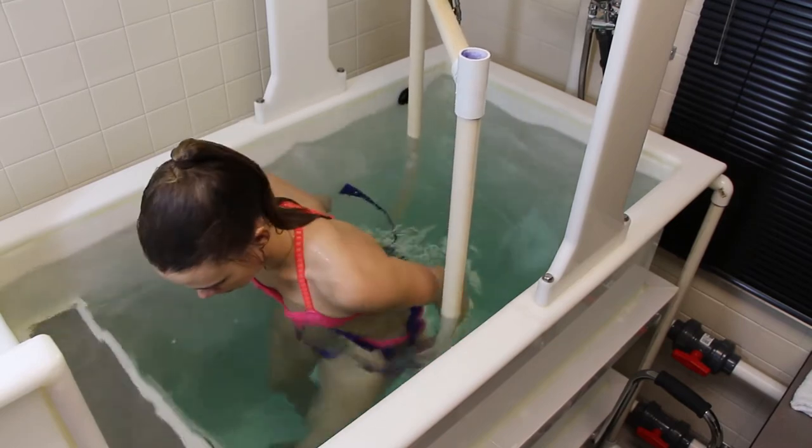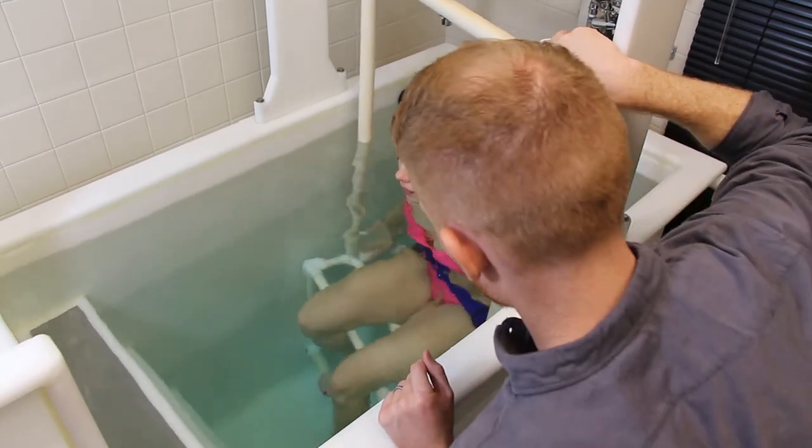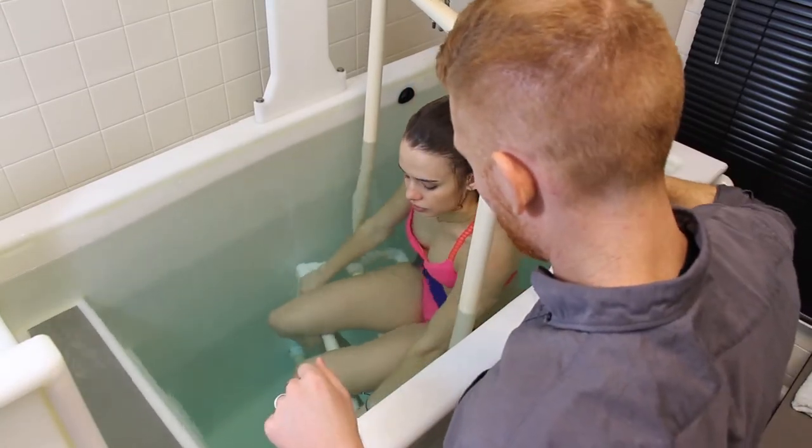Once they've done that, have them sit on the chair in the tank. In this particular tank, you're going to want them to sit all the way back so that the back of their knees is against the bar of the chair — that's going to put their butt actually off the back end of the chair. That's okay because they're going to lean forward, and if you don't put some of their weight on the back of the chair when they lean forward they're going to fly forward too much. Have their feet on the bar underneath them and have them grab the chair next to their legs — don't have them grab the rails on the sides. The reason is they cannot touch the walls or floor of the tank.